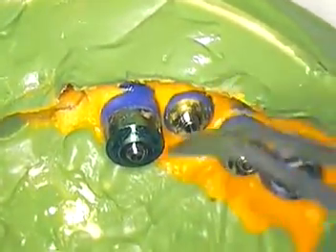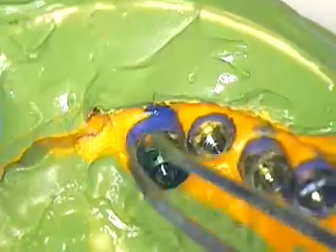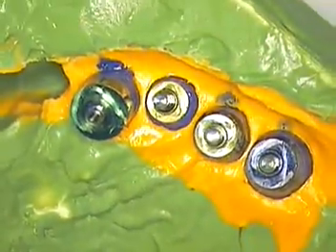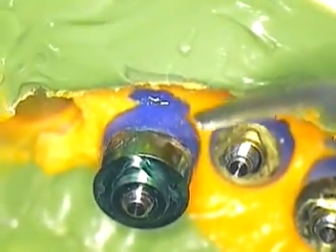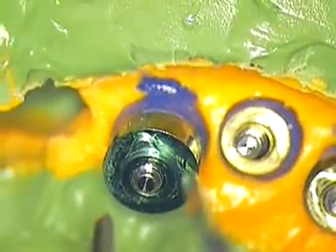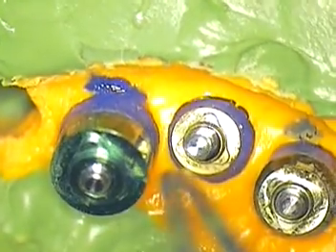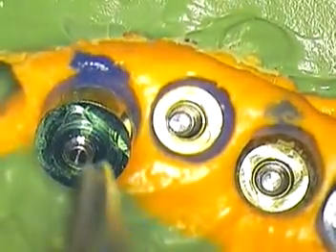They don't make them that long. So if you don't modify it, you're going to get tissue collapse and a nightmare for your lab to figure out what's going on. What I mean is that I've manually extended with composite — adding composite to the impression coping, which is a 6.0 in the cuspid region — careful to allow enough room to stay in between it and the implant next door.